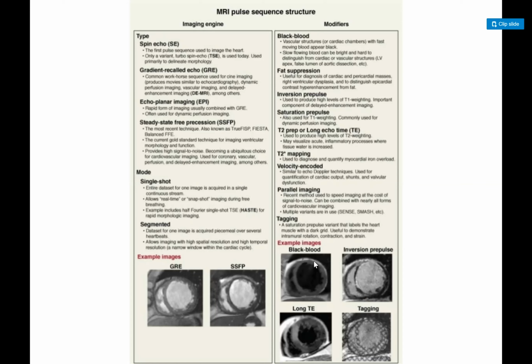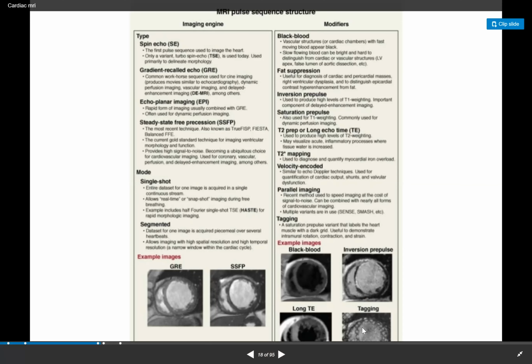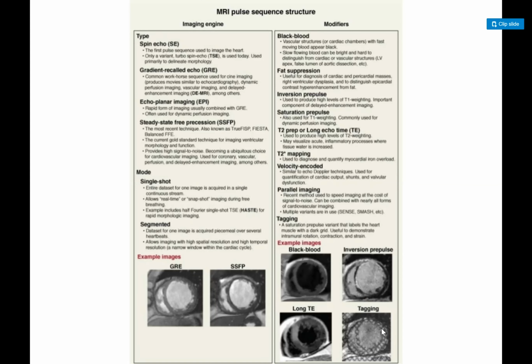Then there is something called tagging, which, as you can see down in the rightmost corner, is where we put pulses inside the heart or the myocardium and null them, make them black. The reason for doing this is that we want to see the motion. This just accentuates the motion of the myocardium.